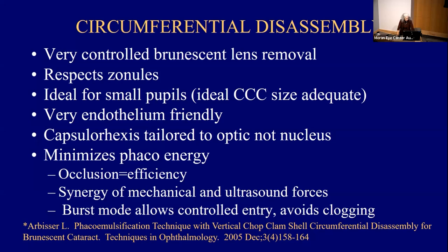And it minimizes phaco energy because, as you'll see, we only use ultrasound to gain purchase in order to apply mechanical forces and then to assist aspiration flow as needed. And one thing that people no longer use very much, and it's a real pity in my opinion, is burst mode, which still is on the machines. And I want to explain that to you.